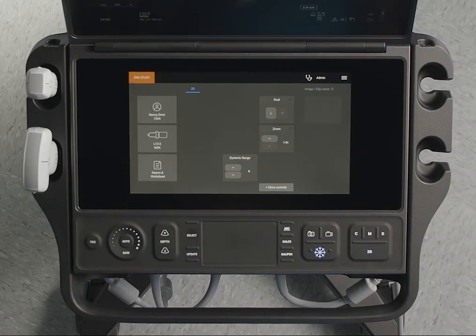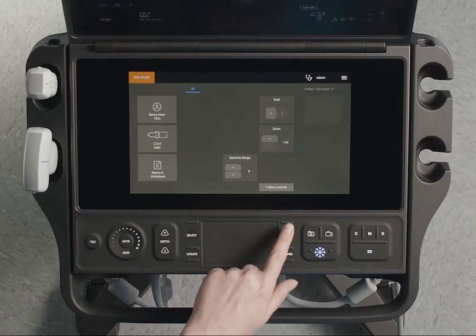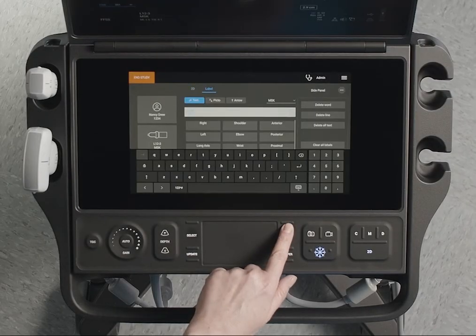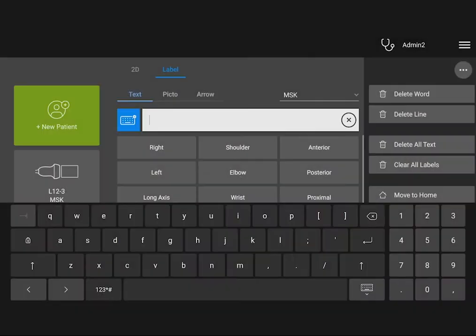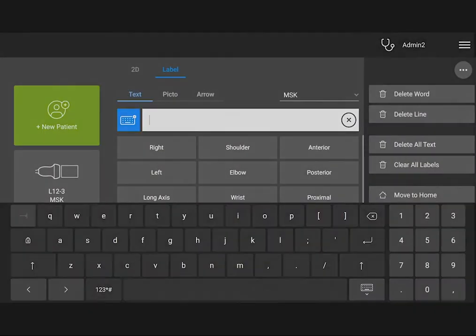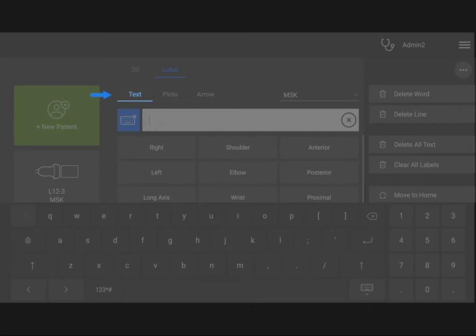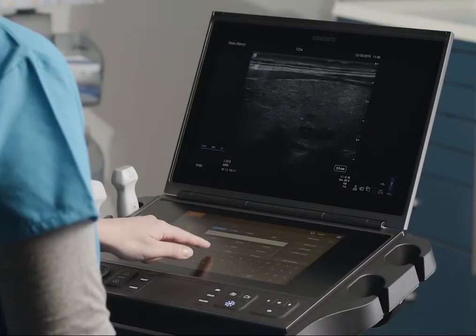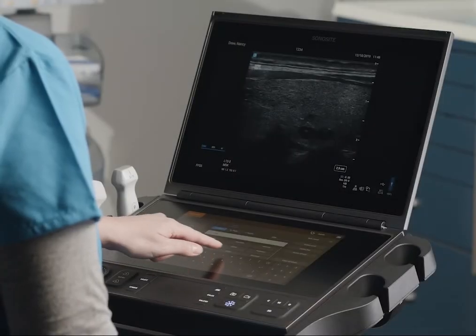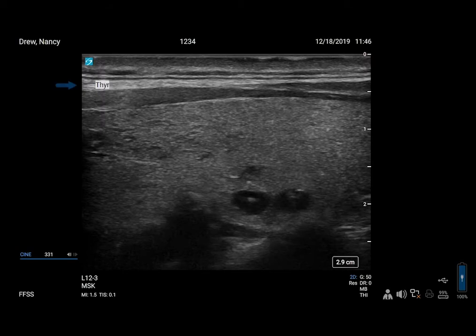First, let's create a text label. Press the Label button to access the Annotations page. You'll see several options on the Annotations page. To add a text label, select Text. Now, type in a label. Notice that the label appears on the monitor in the default home position.